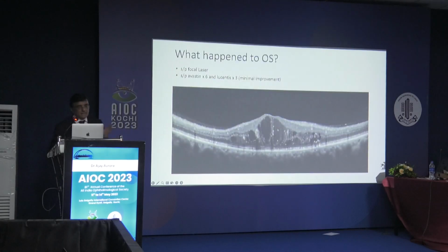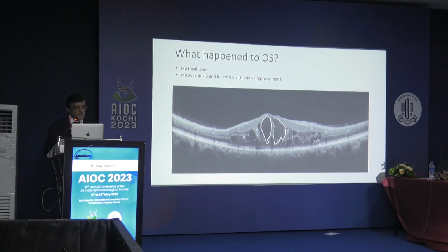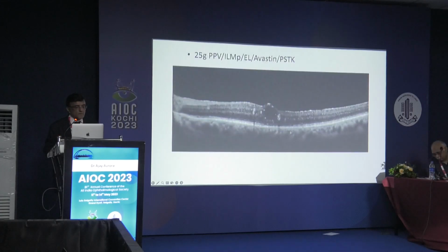Now, the same patient in the left eye, we looked at, the patient has large cystic spaces. You can mark them out and show to the patient, who has got multiple hyperreflective dots, which means this patient would be better treated with steroids.